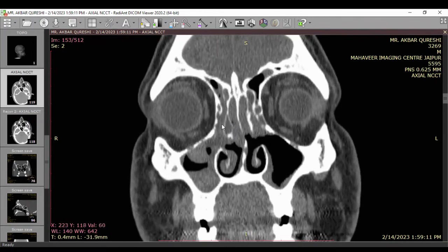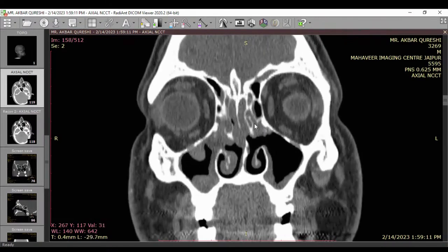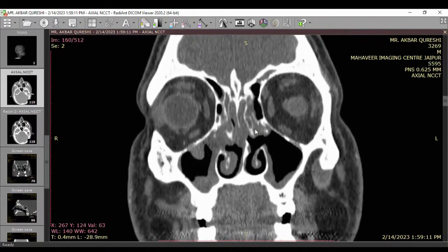And see this. This turbinate is pneumatized. This is known as concha bullosa. Can you see? And this is full of disease, unaerated. Concha you may find aerated once it is receiving aeration, and this has no ventilation, and see it is inflamed. Can you see? See on the opposite side, the entire turbinate lamella is pneumatized. This is a lamellar cell.